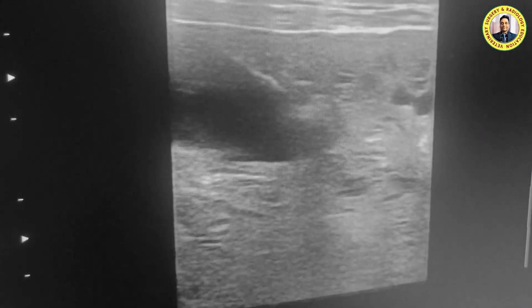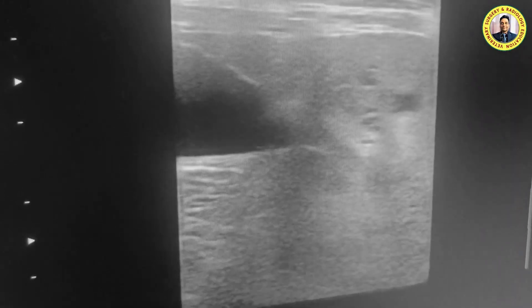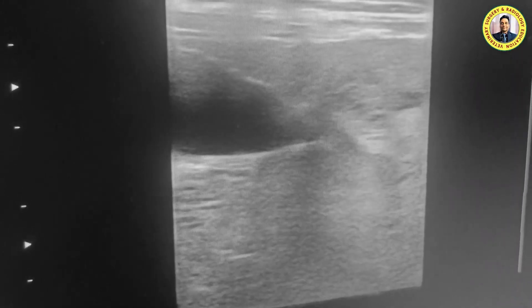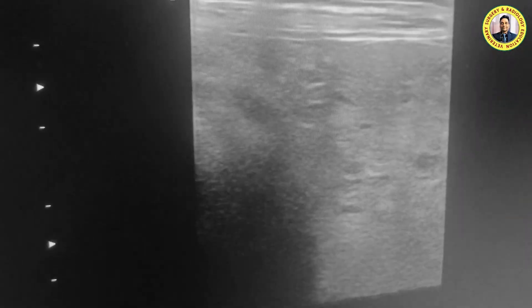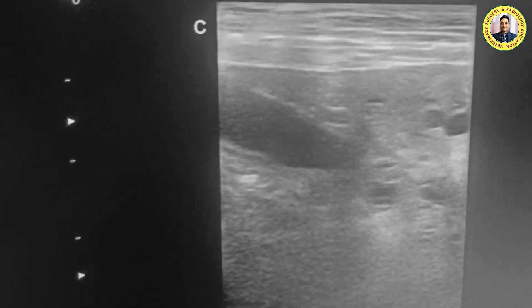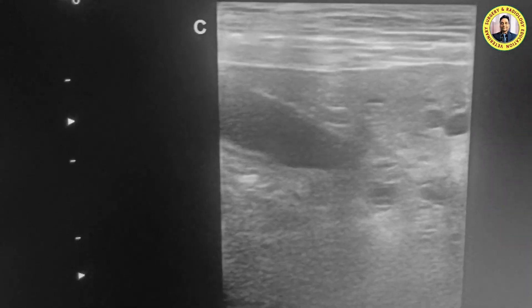Here in this caudal region we find the prostate. This is the prostate — this is one of the most common structures seen in this region.